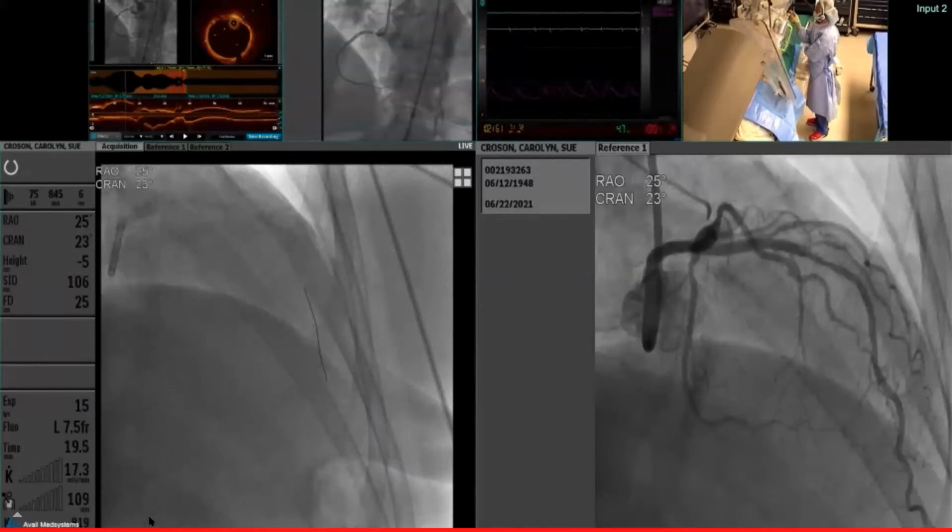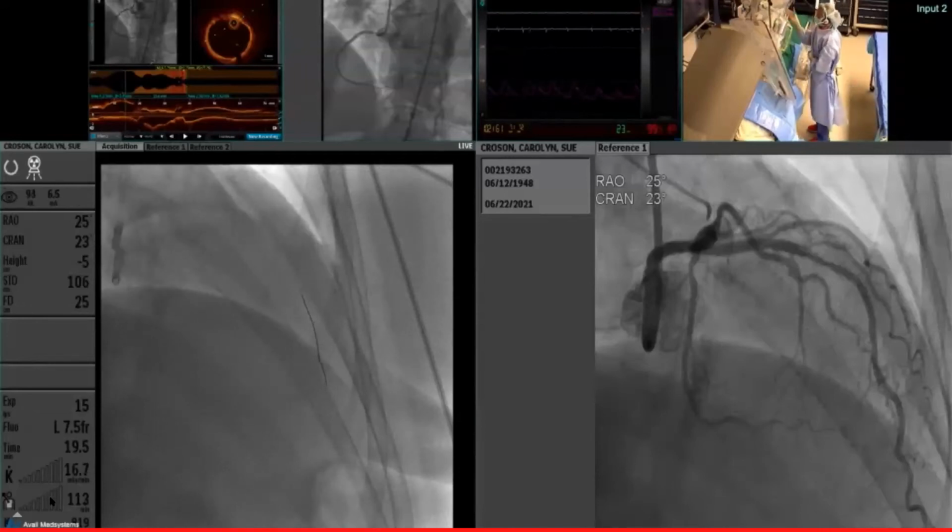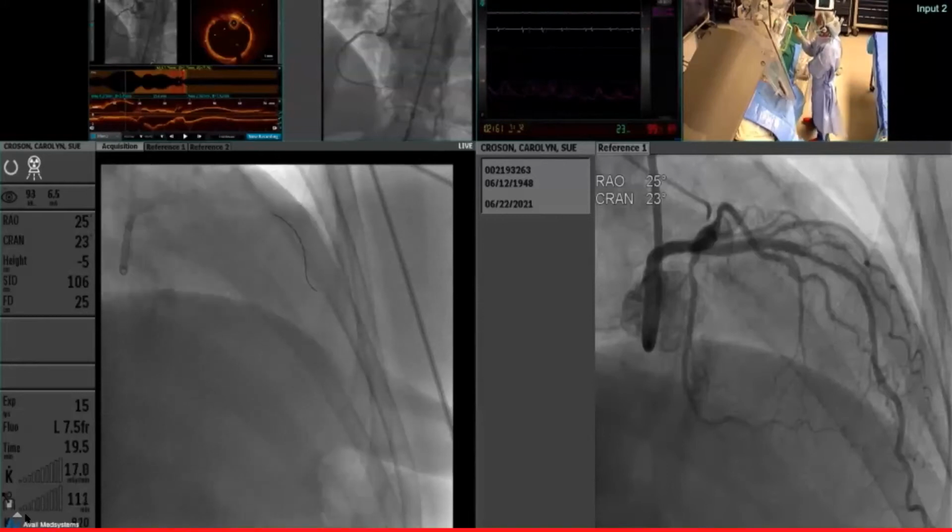And then you can see I have a camera on the room where I can actually see Samantha. You can turn and wave to the camera there. So there's Sam, and we have 2 cameras in the room that, if I were curious or concerned about something, I can zoom in on with a remote control right here to see it. So this is what I actually see from the robot. I'm going to go ahead and just back the wire out. You can see the wire coming back.